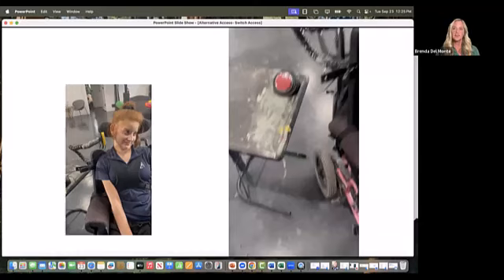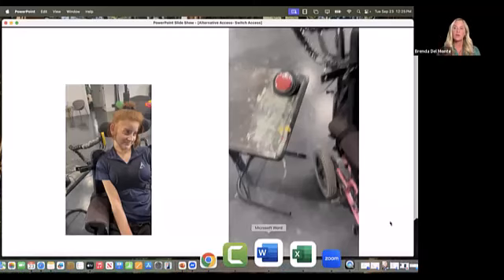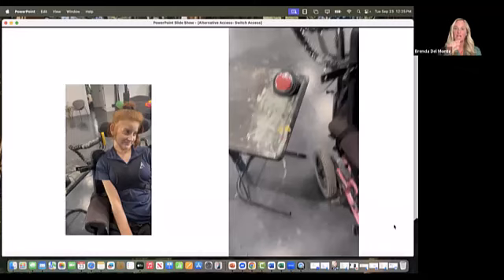So what we've done is we've connected a switch to a step-by-step that just says that's the one. She doesn't have a communication device. She does, but not here today. You don't have any of that iPad nonsense. We don't have anything that fancy. And one voice output switch that allows you to trial some of this, and all it says is that's the one. It gets them listening to choices and hitting the switch when they hear the one they want, which is the kind of linguistic task that we're tacking on to a switch activity.